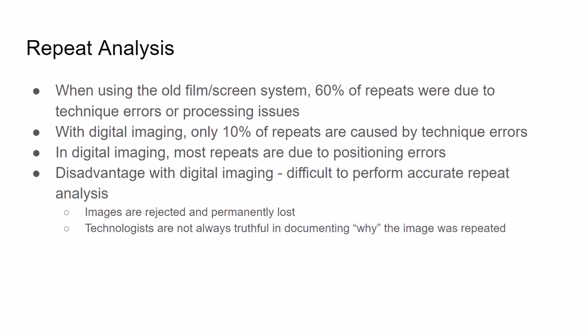You should always be truthful in documenting repeats and the reasons for them. This helps you maintain accountability and provides you with information that you can further use to improve your own skills and ultimately reduce your repeat rates. But the tools are only as good as the data they receive.